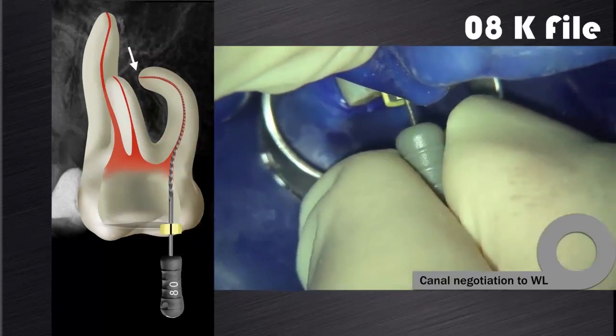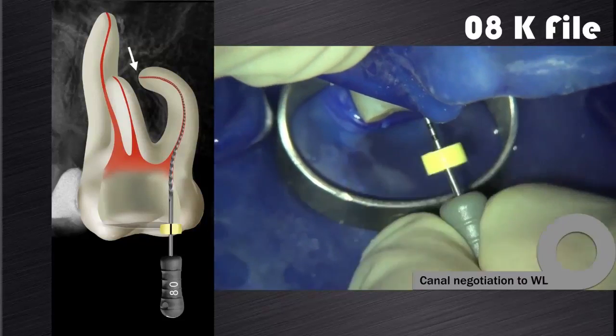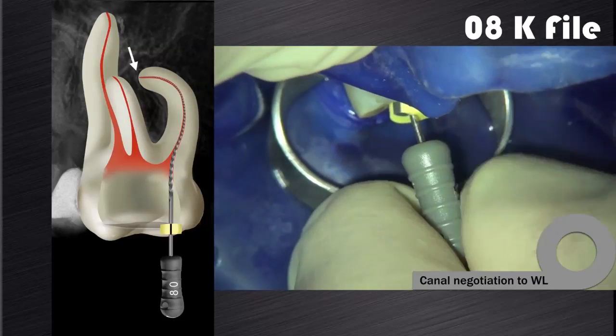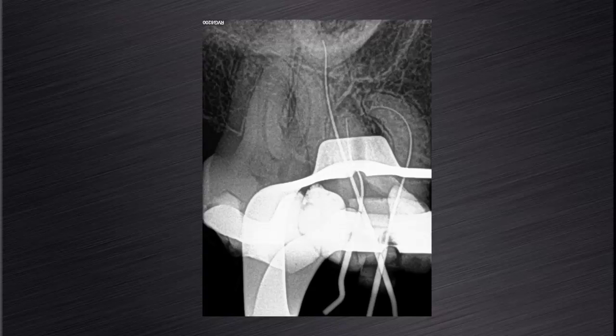You will be amazed to see how many times this protocol enables the same hand file that hung up to progress to full working length or to patency. Here we can see the periapical radiograph of my working length radiograph, clearly illustrating the complex anatomy of the meso-buccal root canal system.